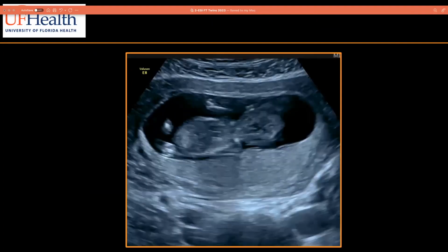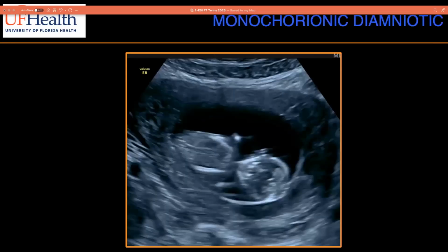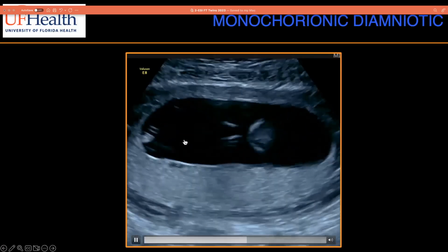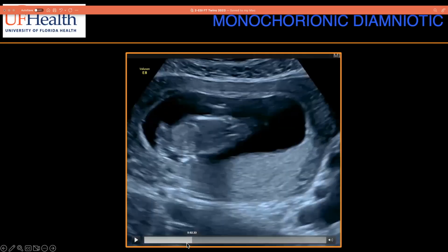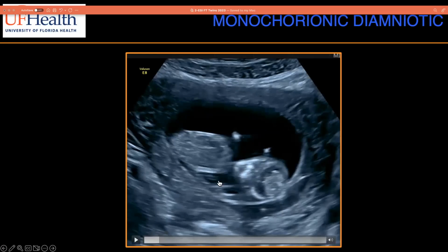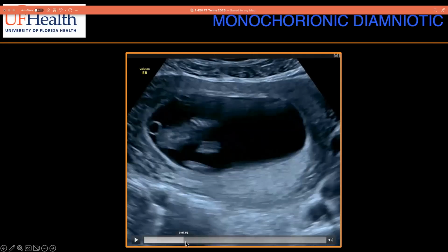And here you have another set that is in very close proximity as you look through, but there is a very thin membrane. And as you slow it down, you will see, let me try to show where that membrane is. This was one of the ones we had difficulty stating, but there is membrane right here around this one. And you can see a hint of it right here as well.